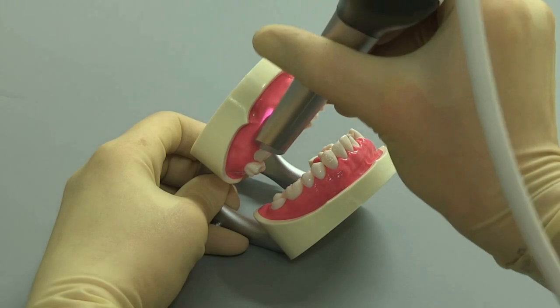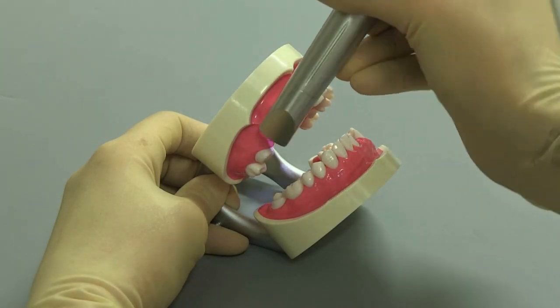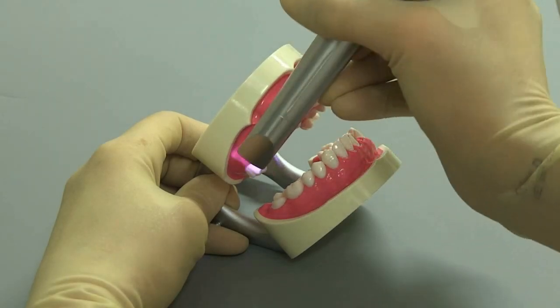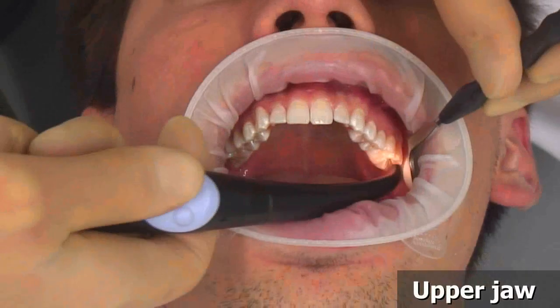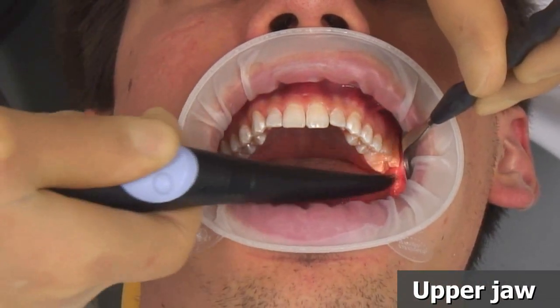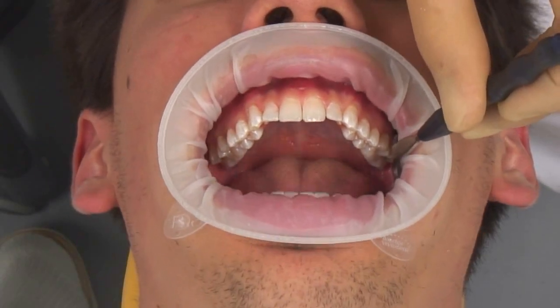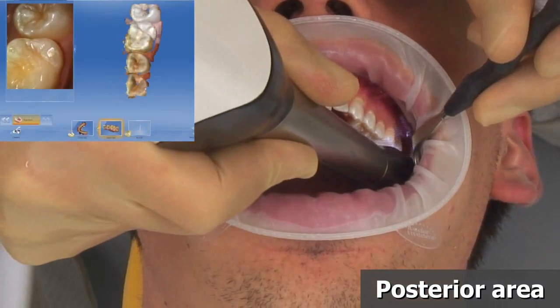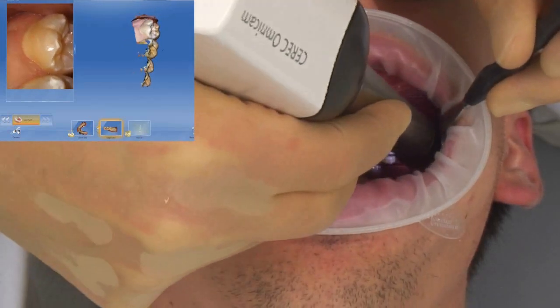Tilt the surface in the distal and mesial direction to gain a better view of the approximate contacts. Just as described for the lower jaw on the model, please now carry out the scanning for the upper jaw.